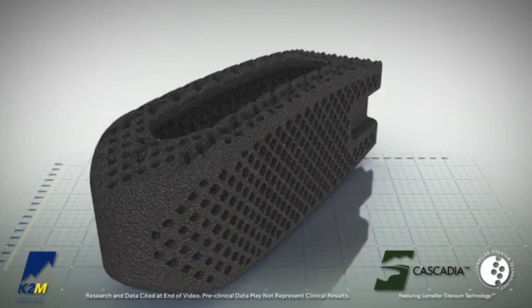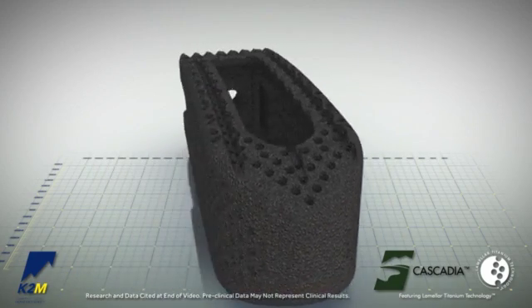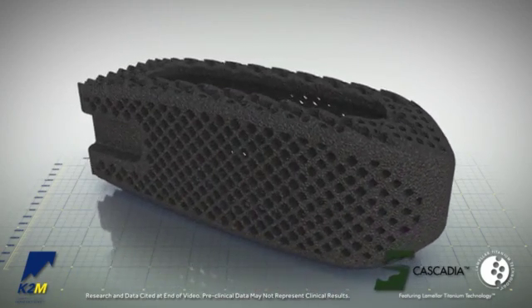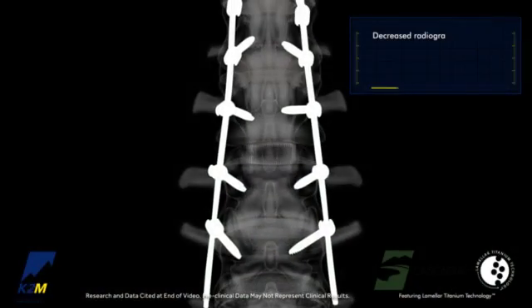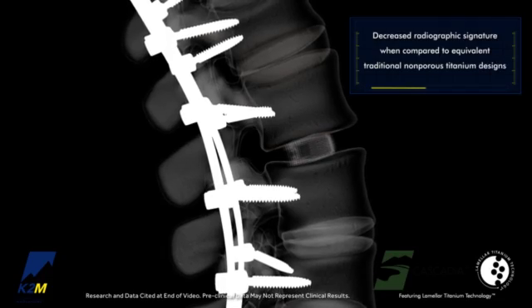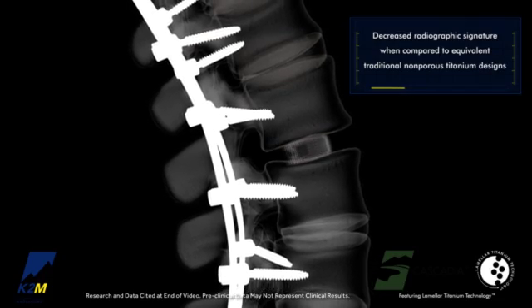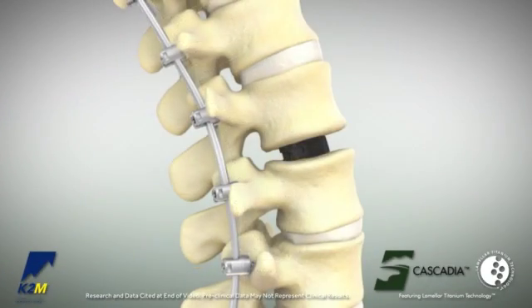The porosity inherent with the lamellar titanium technology, in conjunction with the proprietary design of the Cascadia interbody systems, results in decreased radiographic signature when compared to equivalent traditional non-porous titanium designs.